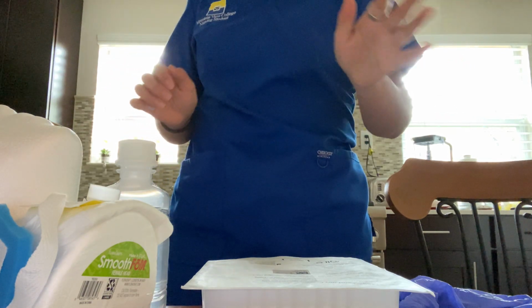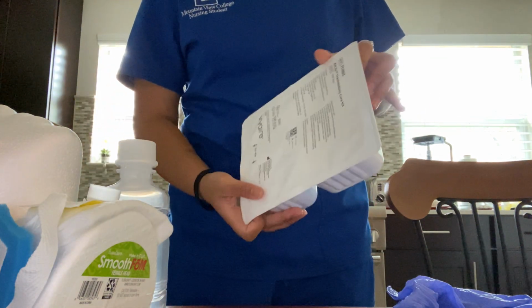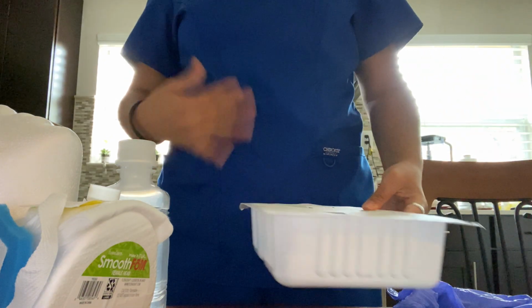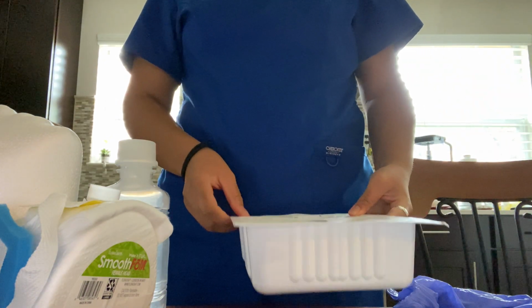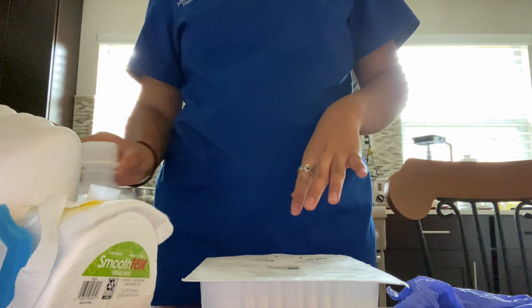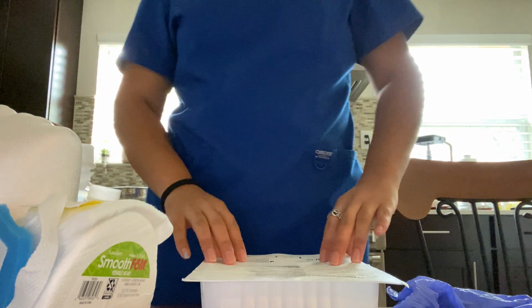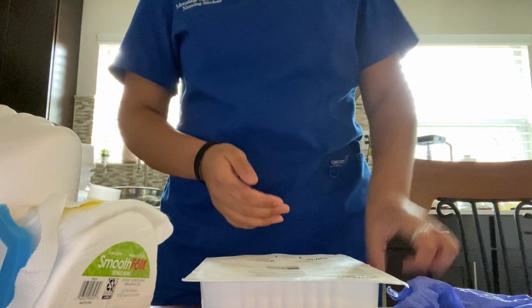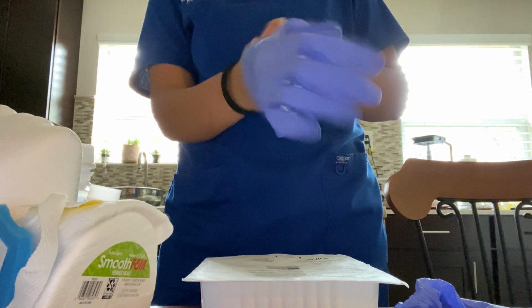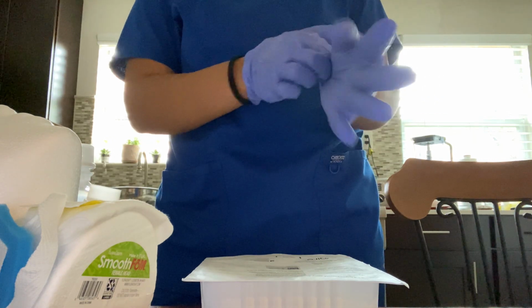Now the cleaning part. So we're going to get our trach kit. This part we're actually going to do. This is your trach kit. Sorry, I'm out of breath. Okay. Verify the expiration dates, making sure everything's good. We're going to just perform hand hygiene and then don the gloves. We made sure we kept the sterility technique through the whole thing.